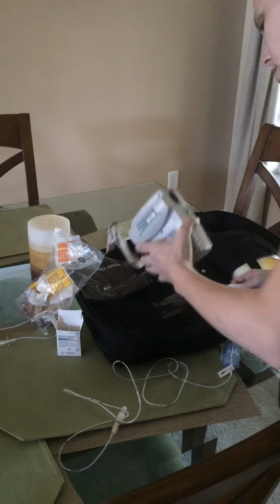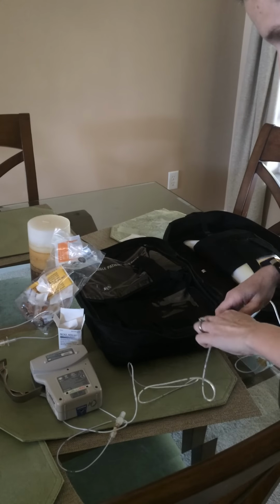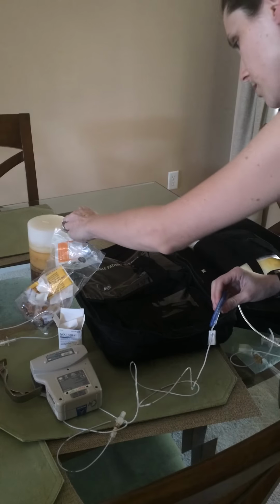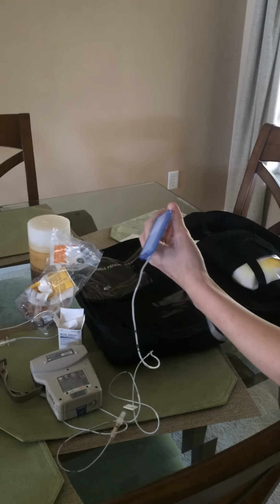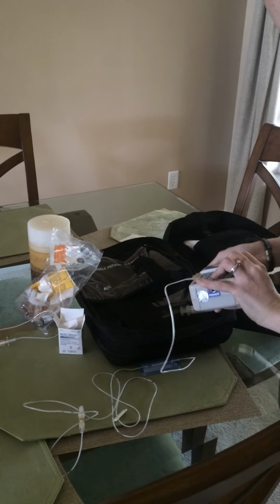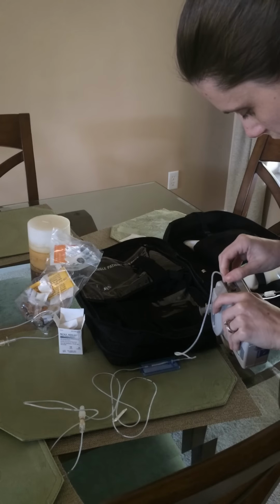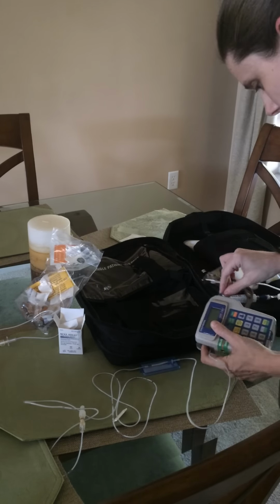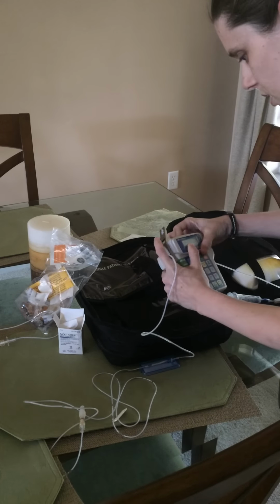Now the next thing I have to do is prime the pump, which means get all the air out of it. Too much air is very dangerous as the PICC line leads to my heart. Same thing for IVs though. I'm sure if there's a nurse friend of mine, they can explain what it can do. I just know that it can kill you. So I have to hook this up into the machine every single time, which is actually kind of tricky.